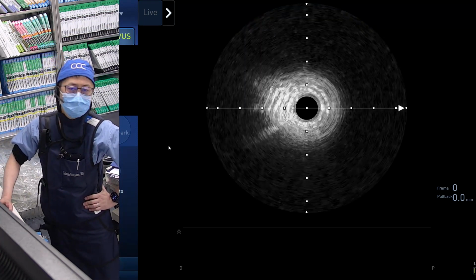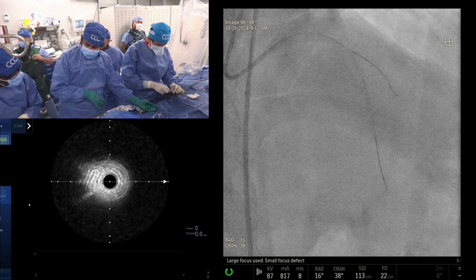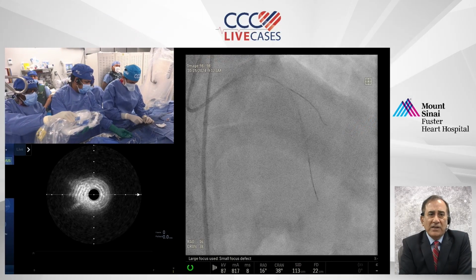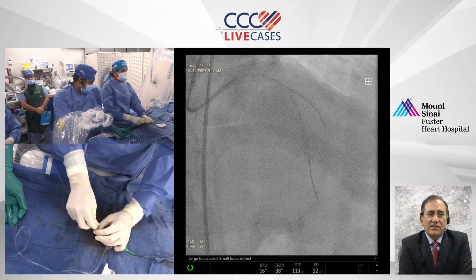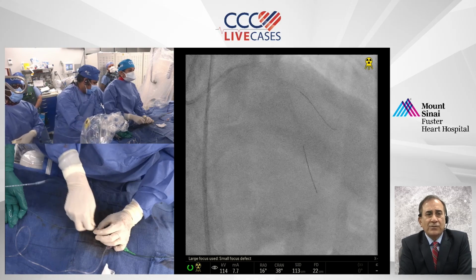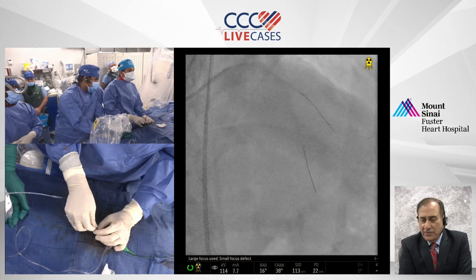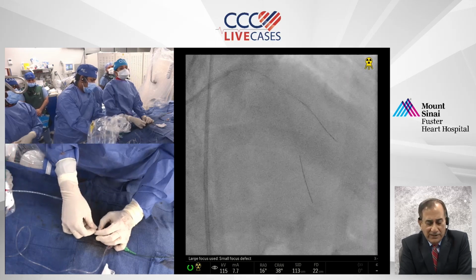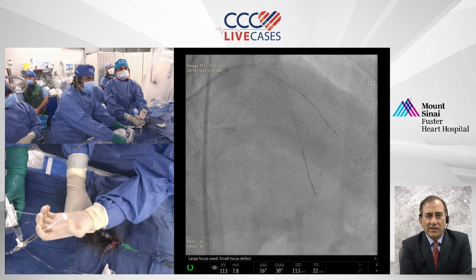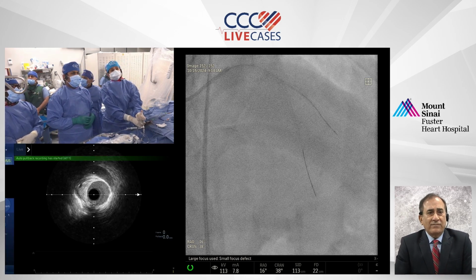One more issue, and again, thank you so much. I truly hope that often this is what people tell you in their conversations regarding CCC live cases, that it truly is comprehensive. You watch the case, then you hear about the clinical trials, and you covered 3 or 4 such relevant trials today. Are you a little surprised that ECMO was not effective?